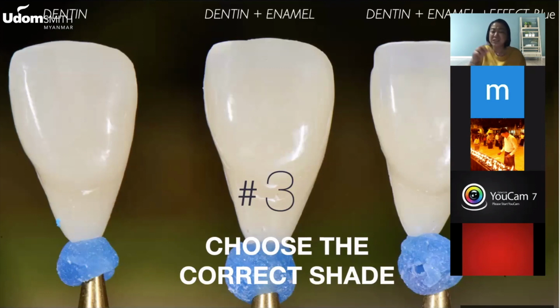However, if the patient wants it whiter, especially nowadays, a lot of patients want it white, like Chiclets already. I don't know if you know Chiclets. This is the chewing gum that looks like a square that looks like a horse's teeth, because it is so white to the point that the teeth are in front of the face already. So if the patient likes that, then you just get A2, A1, the dentin shade, and combine it with the enamel shade of Edelweiss. And then if you have extra time on your hands and you want it even better, then you can use effect shades like effect blue.